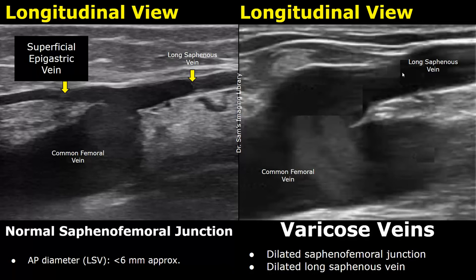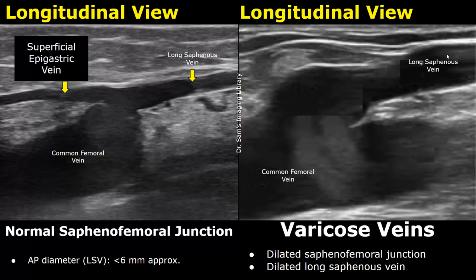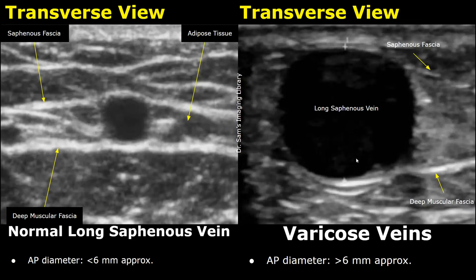Over here is a case of varicose veins. Varicose veins usually occur due to incompetence of the long saphenous vein or short saphenous vein, but the causes are variable. In such cases we may find a dilated saphenofemoral junction and a dilated long saphenous vein. Here is a transverse view showing a dilated long saphenous vein associated with varicose veins — we can see a dilated lumen.